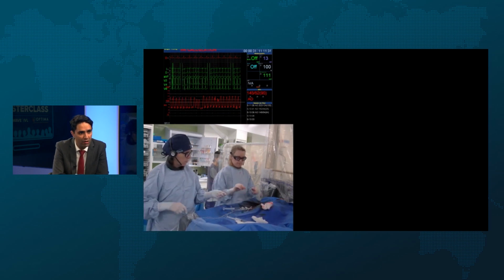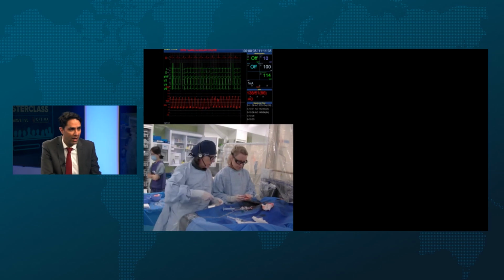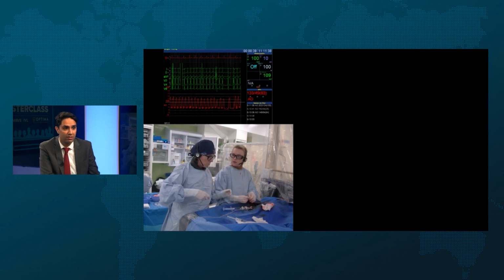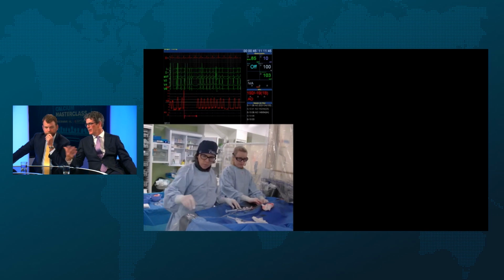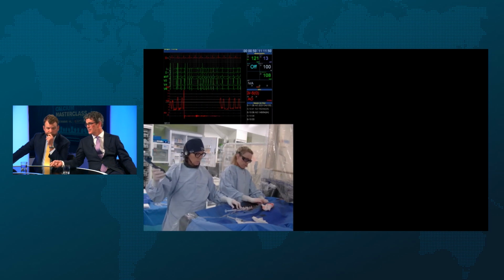But that's the mechanism of failure, right? That's what I was bringing up. We know that in eruptive calcification, the mechanism of failure is reprotrusion through the struts. You must have seen it, Ziad, in some of your OCT studies, that these fully expanded, fully treated nodules can grow back incredibly quickly within a few months sometimes.